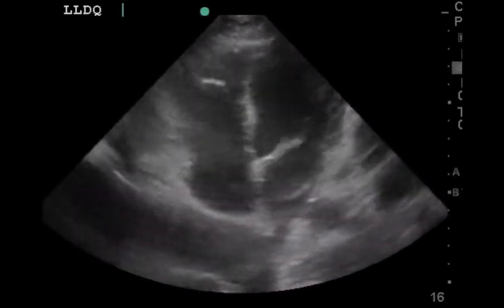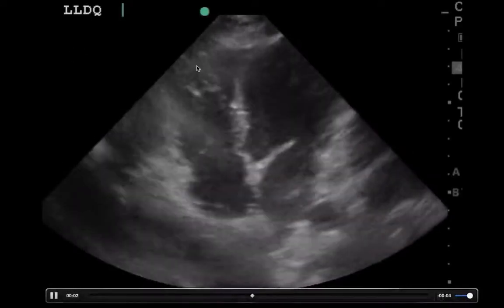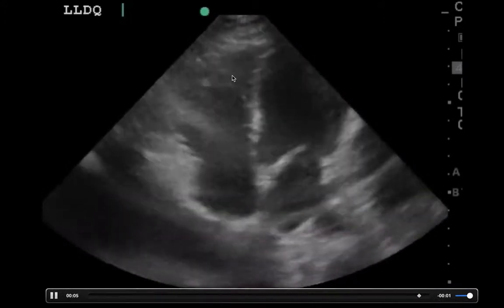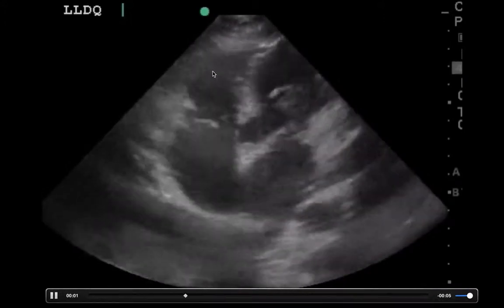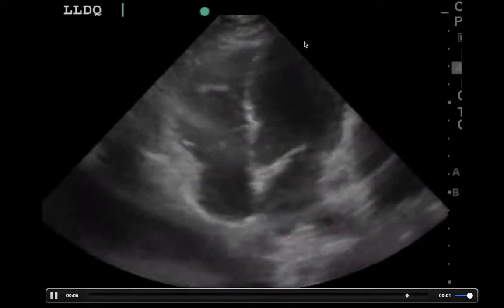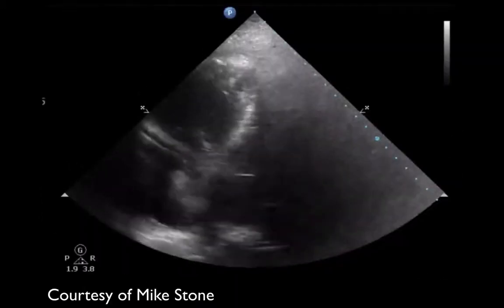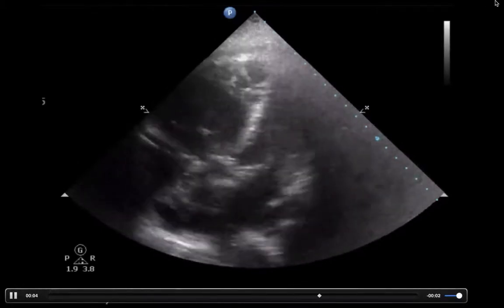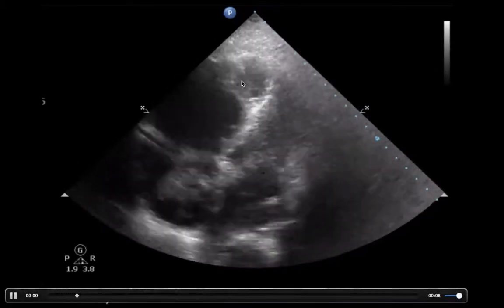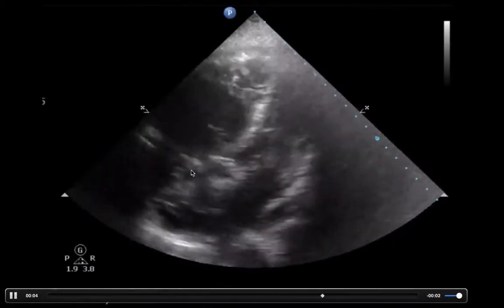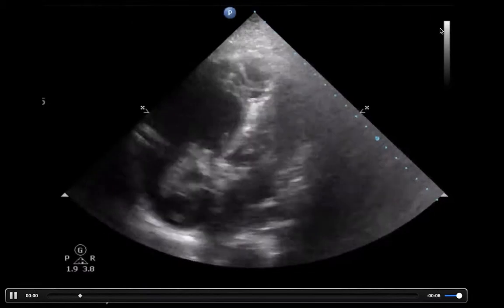Now we should talk about some things that might mess you up. Early on when I was doing these scans, I got really confused about this right here — I thought it might be an actual clot. What this is, is some trabeculae, and that white linear thing right there is something called the moderator band. This is normal to see in the right heart. This is what an actual clot looks like. In this image, courtesy of Mike Stone, you can see the trabeculae with the moderator band, and there's an actual clot rolling around on the right side of the heart. They look very different.